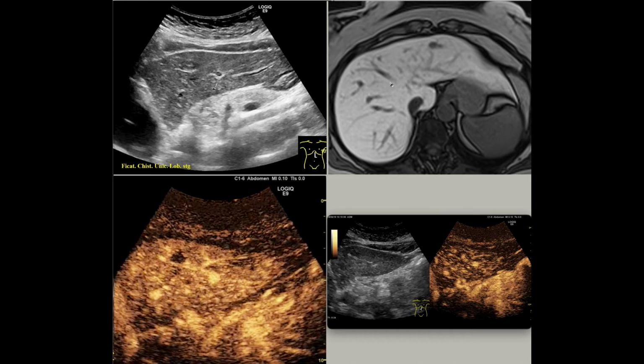On the left we have cranial, caudal, anterior, posterior. The section we see is a longitudinal section, and we can also see the liver capsule with a linear aspect. The liver has a homogeneous structure without signs of restructuring, and important anatomical relationships with the heart, the line of the diaphragm, also with the pancreas and stomach in this area.